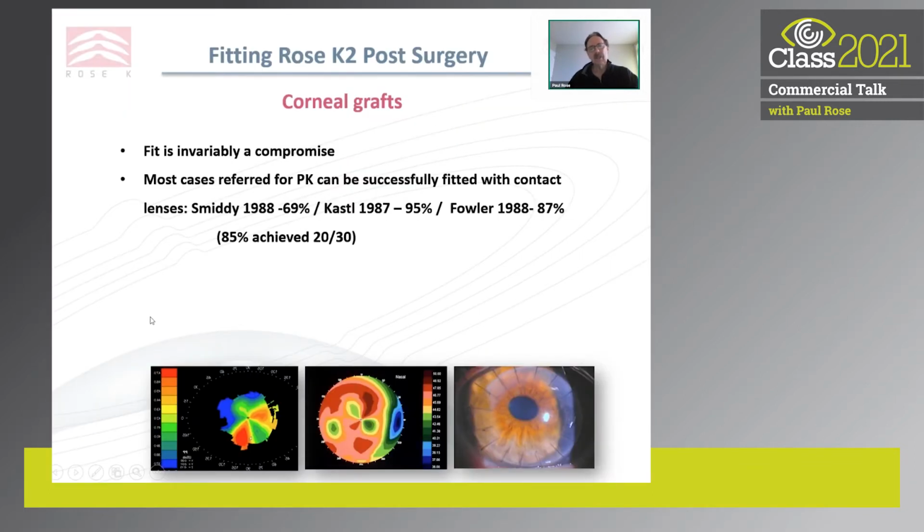So particularly with corneal lenses, a fit is often a compromise. It's very difficult to get a perfect fit, although I'll be showing you some pictures in a moment of some very good fits with a corneal lens on graft. Also to mention the studies, there were 3 studies done many years ago now where patients were referred to specialists to have grafts done. The specialists in their wisdom said, no, I don't think these corneas need grafts. I'd like them to be fitted by an expert keratoconus fitter. They were referred back to these people that are mentioned here.